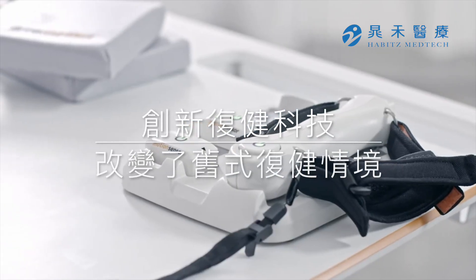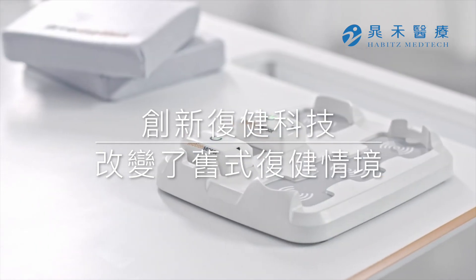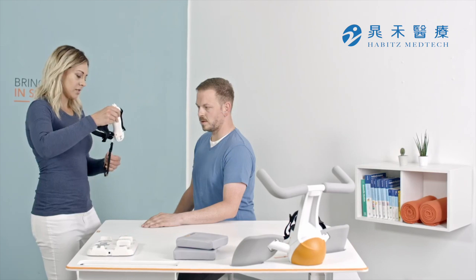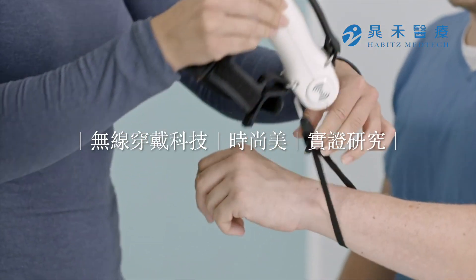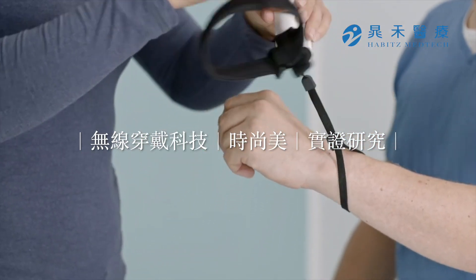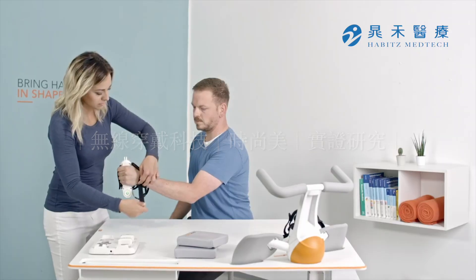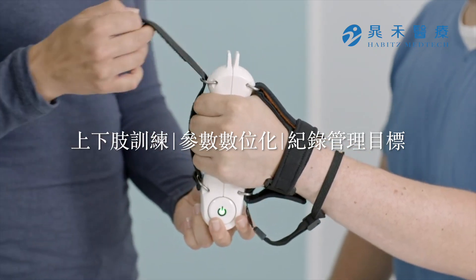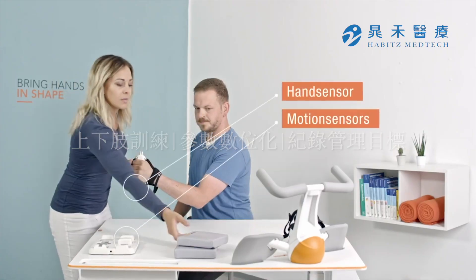Introducing Pablo — a modern wireless assessment and therapy device for the rehabilitation of patients with impaired motor functions that allows therapy for all phases of rehabilitation of the upper and lower extremity, as well as the trunk and head. The core components of the Pablo system are the Pablo hand sensor and the Pablo motion sensors.